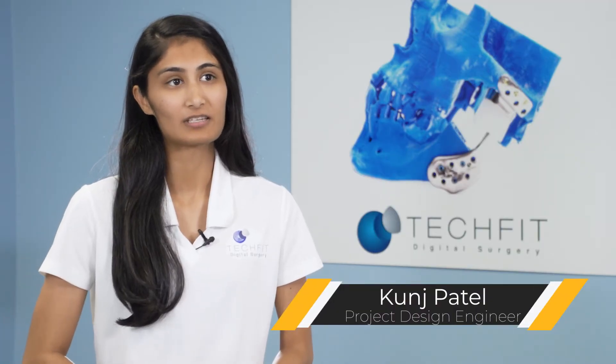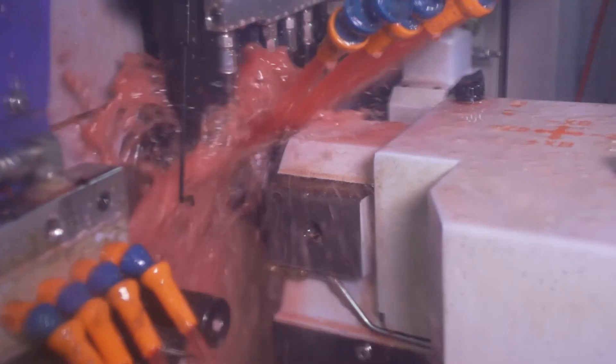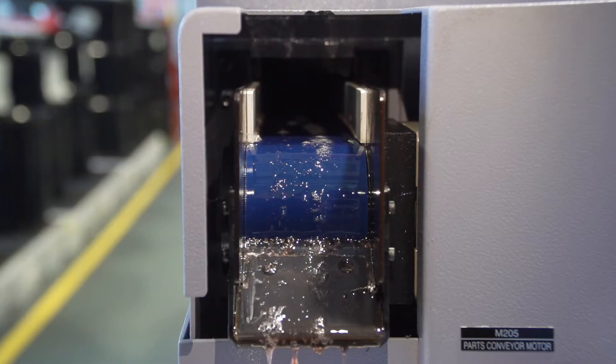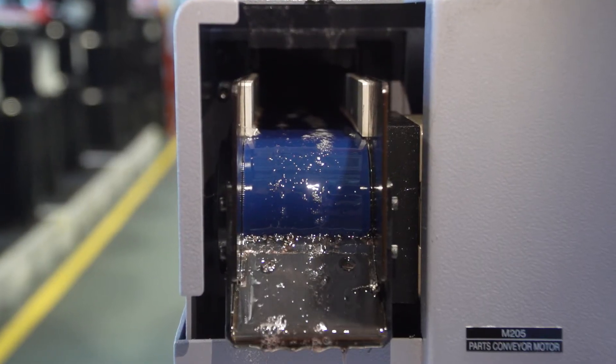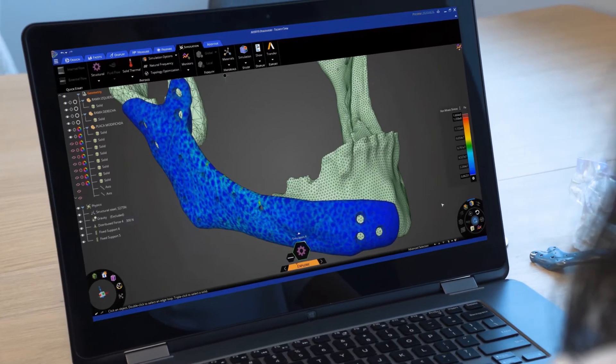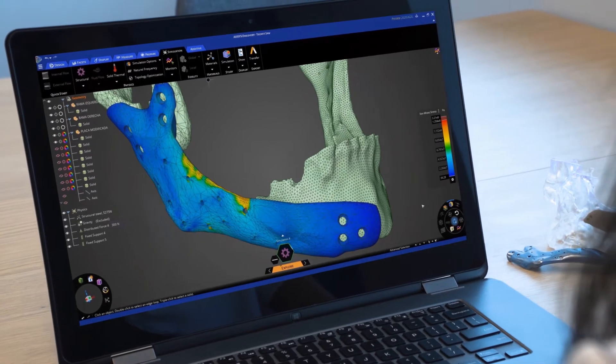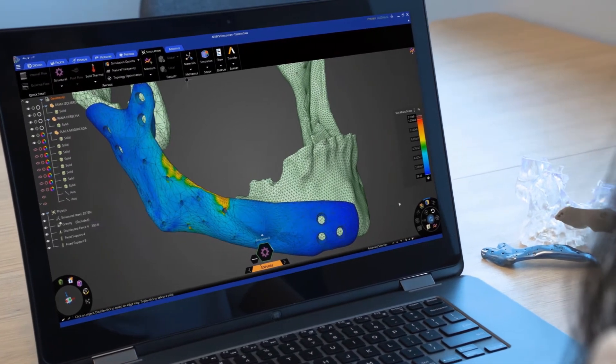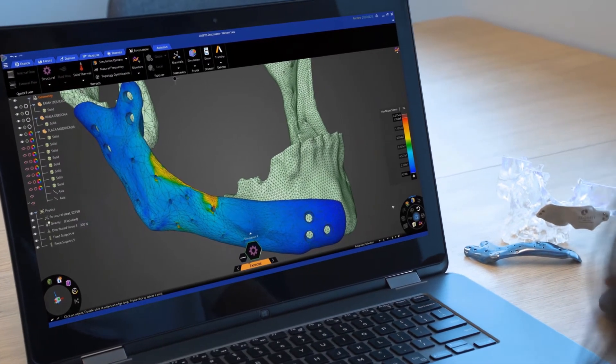Quality control is an important part of our process because the implant design directly impacts the patient's recovery and rehabilitation time. We can quickly model an idea, explore different design scenarios to see if it works, and validate leveraging the trusted ANSYS solvers.